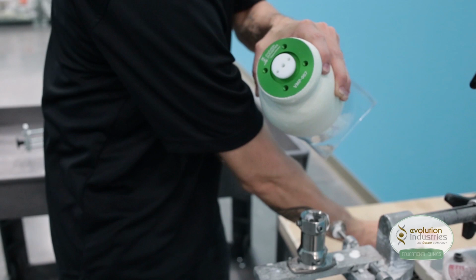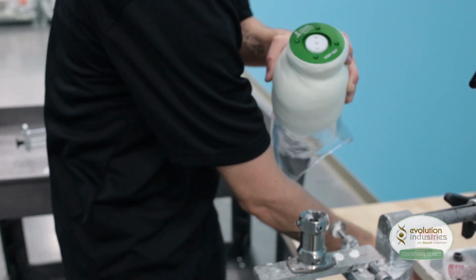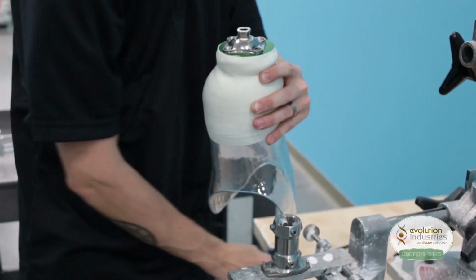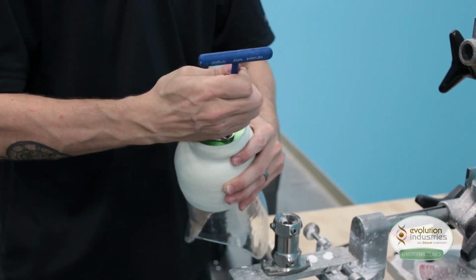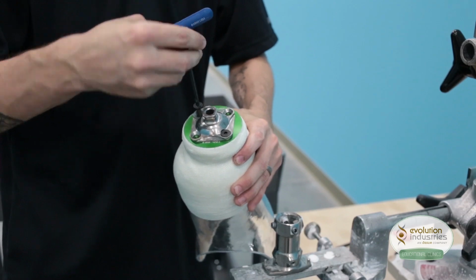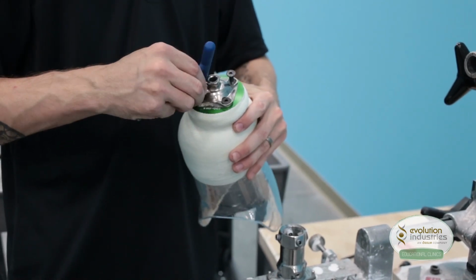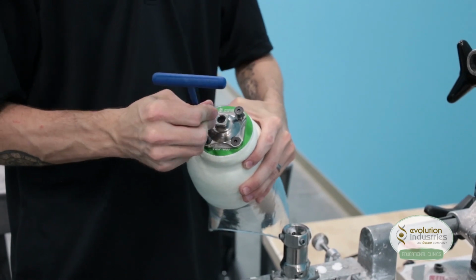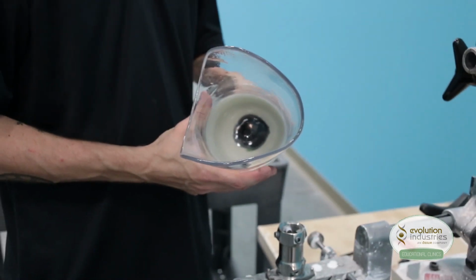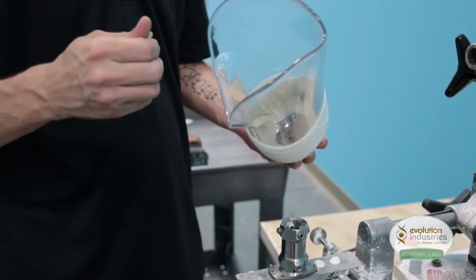Turn it clockwise and then tighten it down. We can replace our adapter with the set screws. And on the inside of the socket, where you previously drilled through for the expulsion valve, you want to use some plumber's putty or something similar, and you want to seal that hole up so your plaster does not leak.